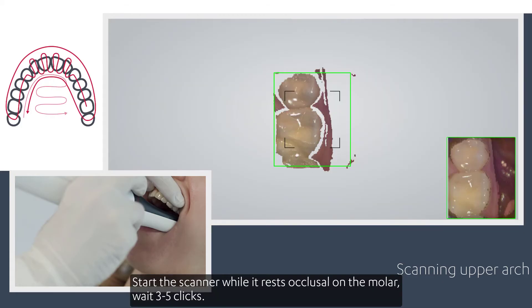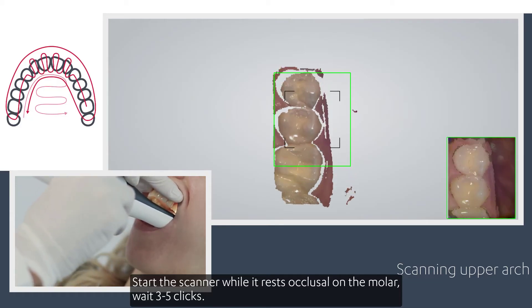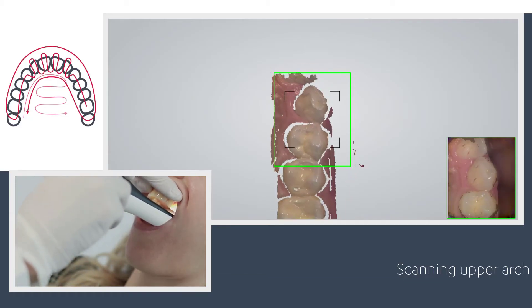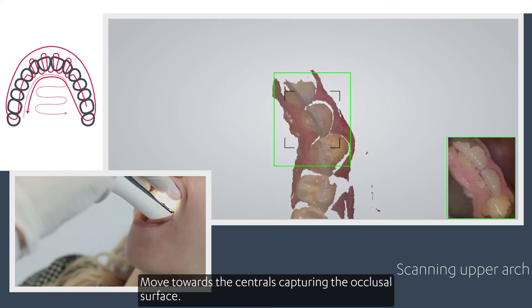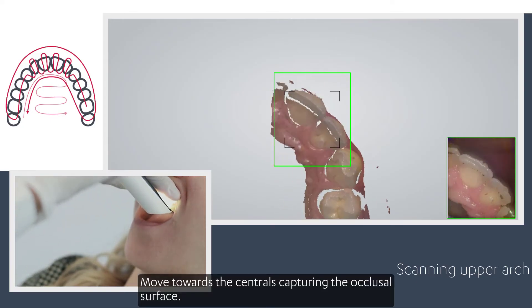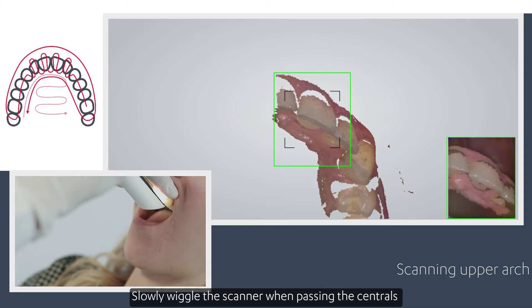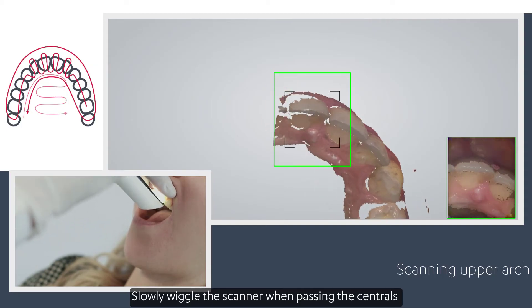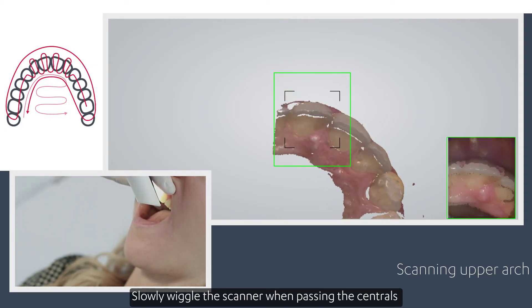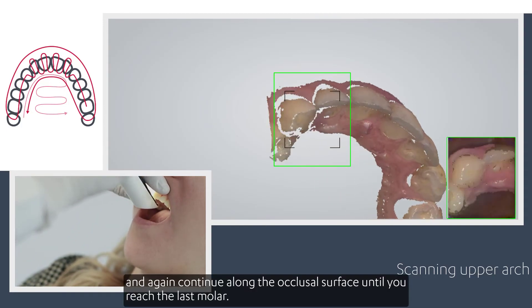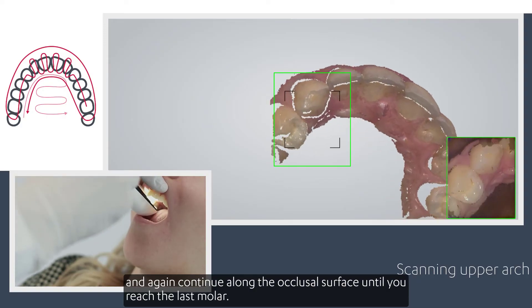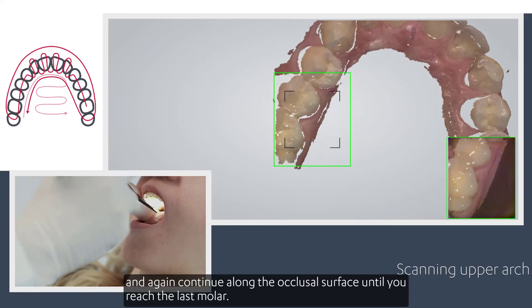Start the scanner while it rests occlusal on the molar. Wait three to five clicks. Move towards the centrals, capturing the occlusal surface. Slowly wiggle the scanner when passing the centrals and continue along the occlusal surface until you reach the last molar.